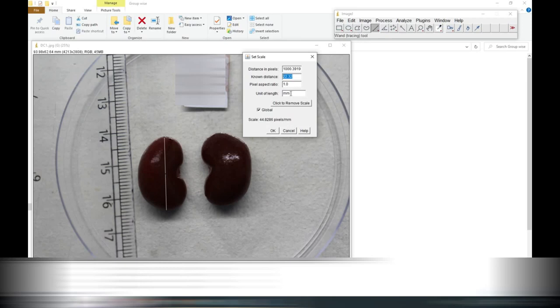Here you can write the length. What is the length of this kidney and likewise other kidney you can measure.